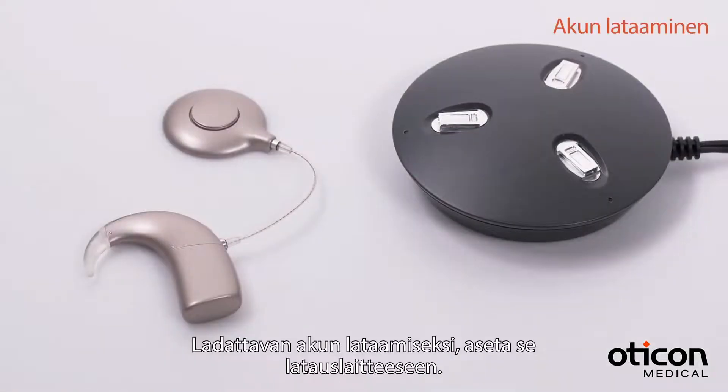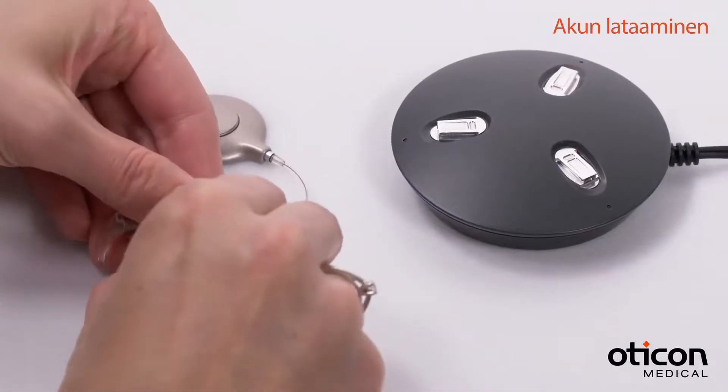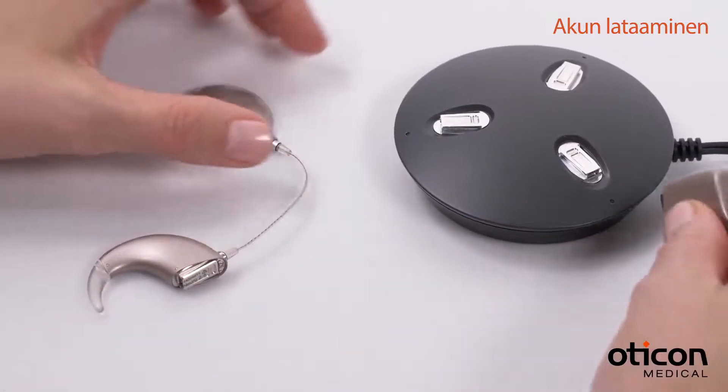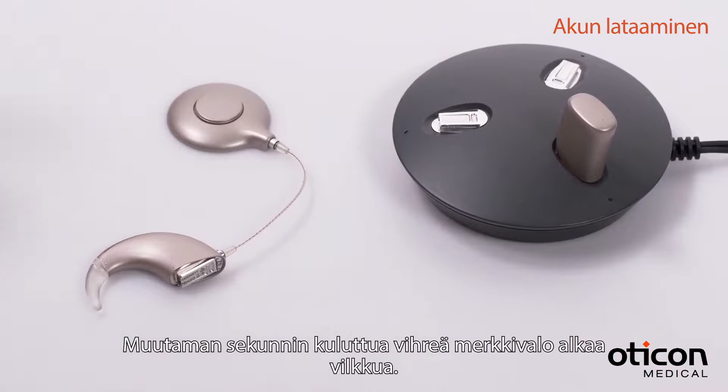To charge a rechargeable battery module, place it on the charger. After a few seconds, the indicator light starts blinking green.